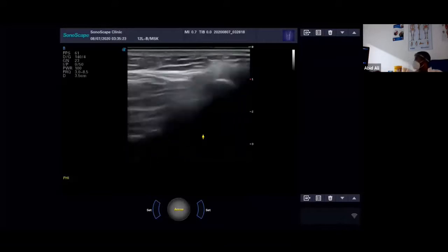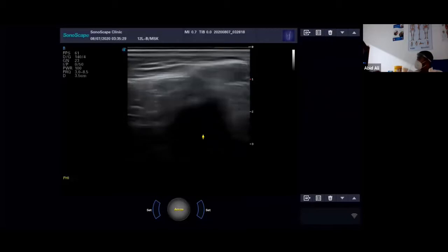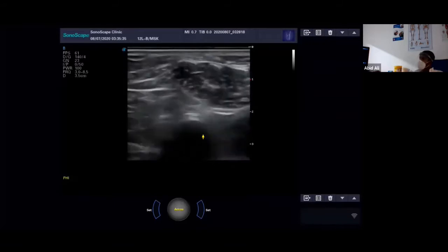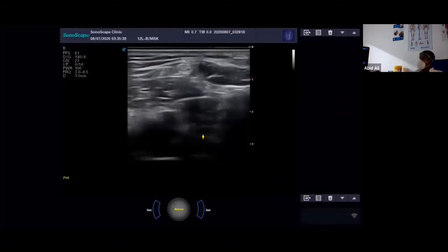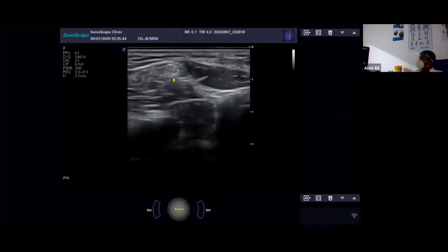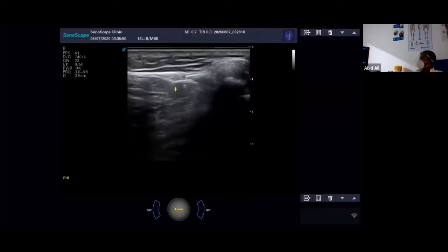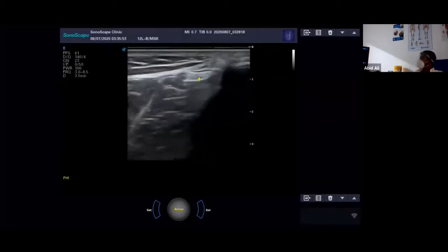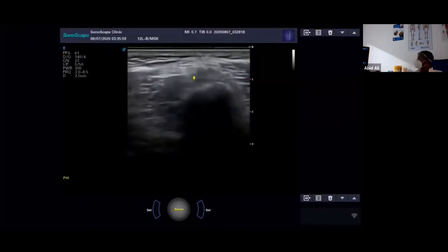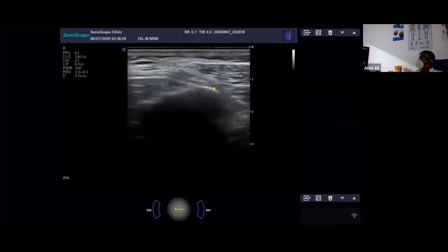We were talking about the peroneal nerve as well, weren't we? Yes, the peroneal nerve is quite nice to identify on ultrasound. Not many people would refer to look at that, probably more for nerve conduction studies, but it's quite interesting to see it. So this is the nerve here. And follow it. There's the fibular head. And it gets really difficult here as you go in the fibula, so I tend to go long section here. And follow it past the fibular head.